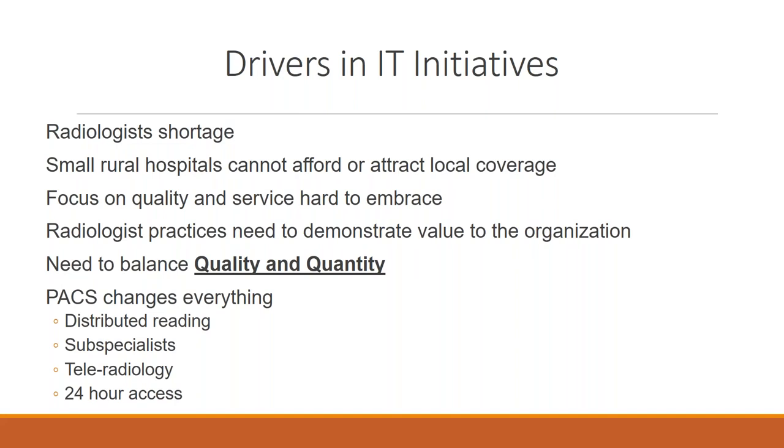So how do you have one doctor or two that has the scope and breadth of expertise to go from MR musculoskeletal to mammography to cardiac CTs? Just a difficult thing to do because that skill set is no longer as broad as it used to be decades ago. Technology has changed that. So what PACS did is it allowed now the smallest of hospitals to have the same scale of skill set as somebody like the Cleveland Clinic or the Mass Generals or the Cedars-Sinai.